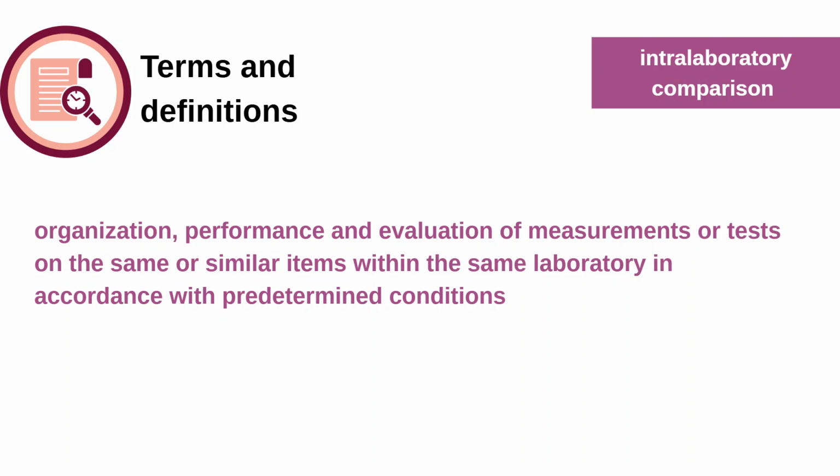What is the value I'm getting in the testing device? And I'll do the same thing once again. I'll do the same thing again. So when I do it in multiple iterations, I'll see how the results are, whether it is the same or different. It should usually be the same. Even if there are small changes, it is acceptable. So that is intra-laboratory comparison.